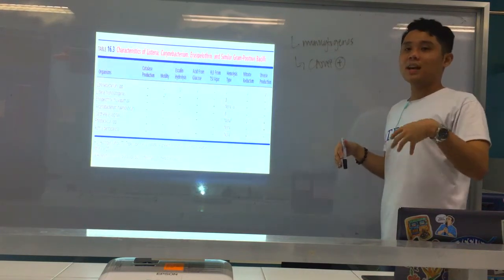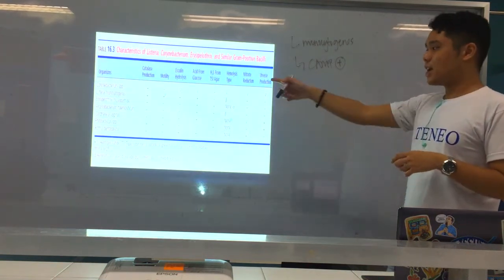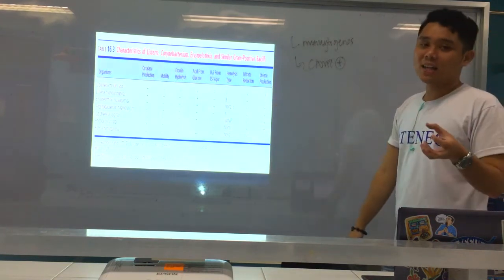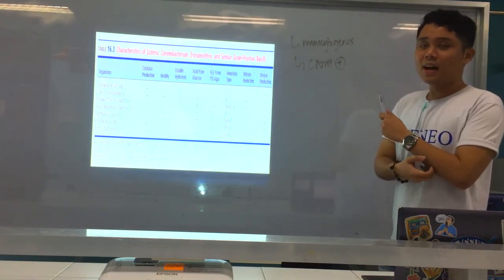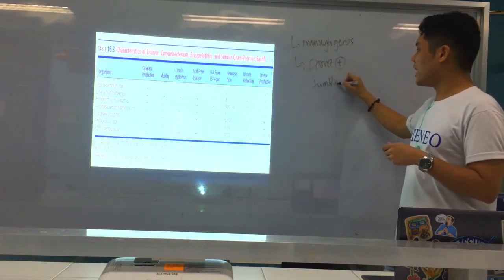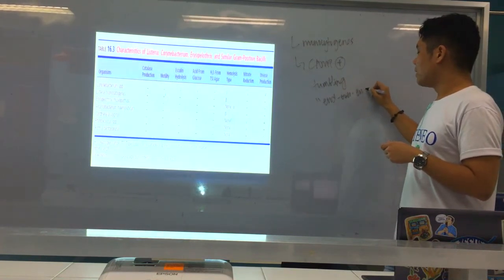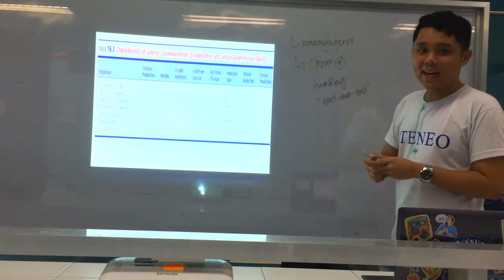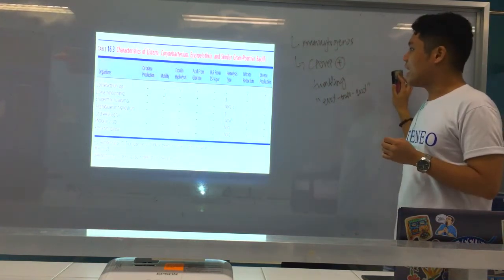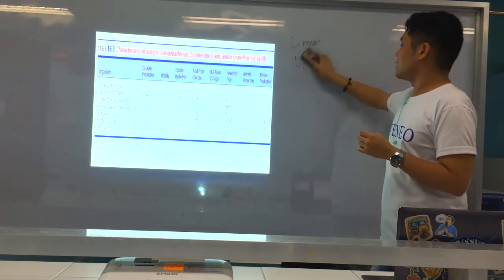Okay? So, if it's a bacillus, CAMP positive, then that could be Listeria monocytogenes. Okay? Another one is, of course, it's esculin hydrolysis positive. Motility. The special characteristic of Listeria is the tumbling motility, right? Tumbling or end over end. There, end over end. Motility. Tumbling motility, end over end motility. We keep coming back to it, right? So again, that's Listeria monocytogenes. Okay, alright. Okay, next.